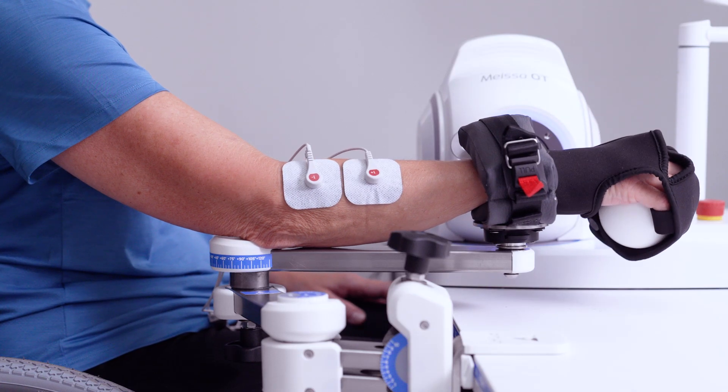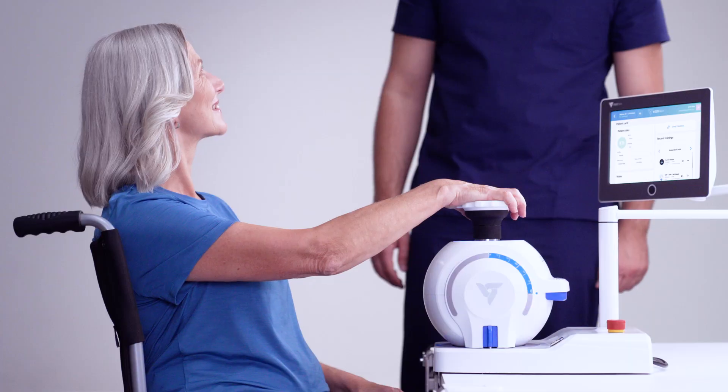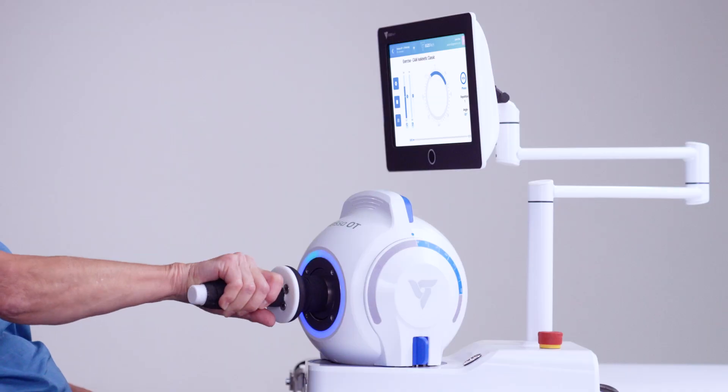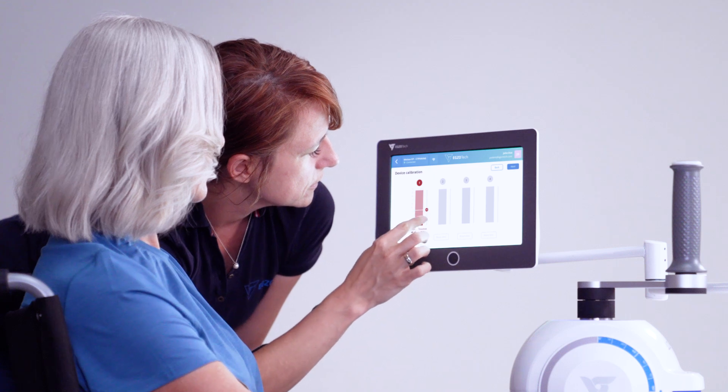We're able to work via isolated movements or through interchangeable extensions. Patients can train how to open a jar, operate a screwdriver, or open a door. This can be assisted or trained via controlled resistance.